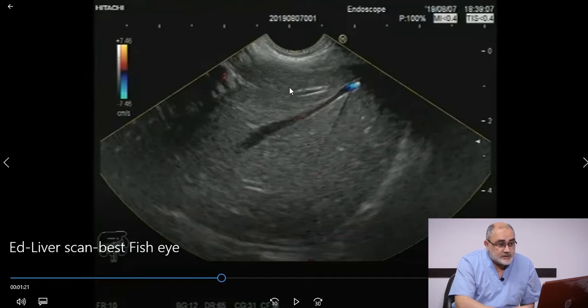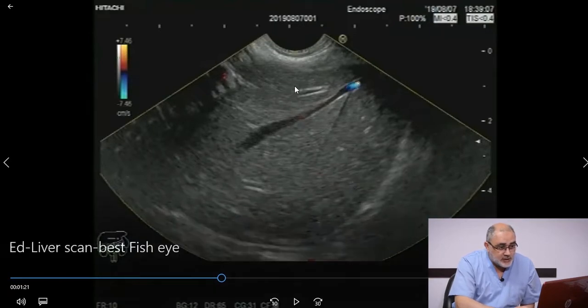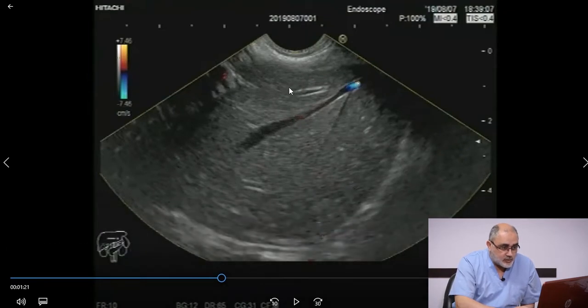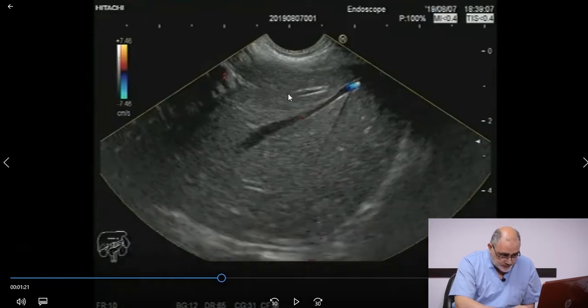And here segment 2 is the best segment for interventional endoscopic ultrasound in biliary drainage. It is very good for the rendezvous technique and antegrade biliary stenting because it is more in line with the left hepatic duct, the common hepatic duct and common bile duct. While segment 3 is very nice for hepaticogastrostomy. But segment 2 is very suitable for the rendezvous technique and antegrade biliary stenting.